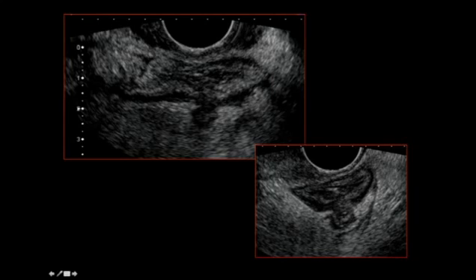And here we have a beautiful picture of the sigmoid colon on a transverse scan. I'll draw your attention to the outer muscular layer, which is more thickened than normal, a good sign for diverticular disease. We find the tick at the epicenter of maximum wall thickening and maximum inflammatory fat embedded in this echogenic mass-like non-compressible fat, and this is the location of the patient's maximum tenderness. The other thing I'd like to draw your attention to here is the fact that often the bowel wall layers at the neck of the diverticulum are disrupted, and that is not a worrisome finding.